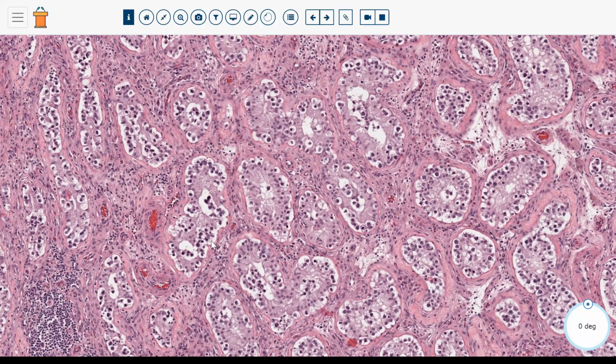So carcinoma in situ is sort of a misnomer because germ cells are not epithelial cells. They're actually their own distinct cell type. And the flaw in intratubular germ cell neoplasia unclassified, or IGCNU, is that by using the word unclassified, it almost implies that we don't know exactly what this is. But in fact, this is the most common and the presumptive precursor lesion to malignant germ cell tumors of the postpubertal testis.